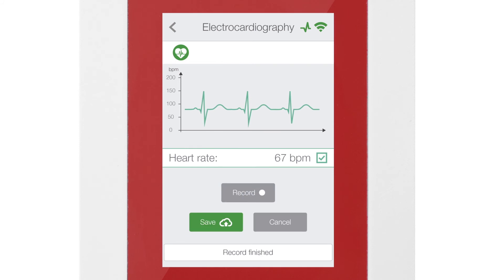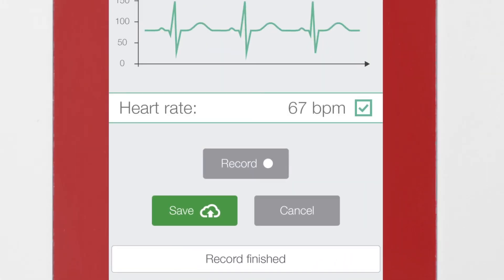Once the recording finishes, you can delete the measure by clicking on the Cancel button, or upload it to the cloud by clicking on the Save button.